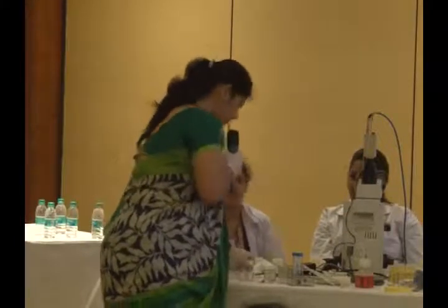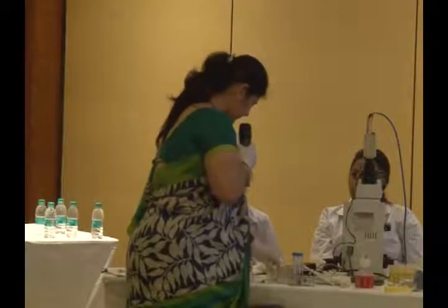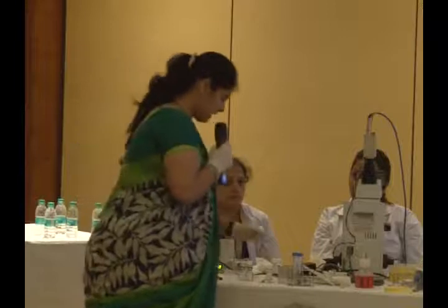First we do the swim up because it takes 45 minutes. So we take the sperm wash medium. For swim up, we take sperm wash medium and the semen sample. These are the two requirements for swim up. We take a round bottom tube.